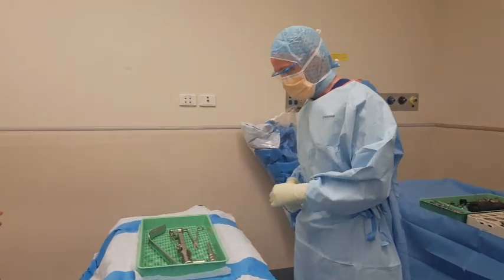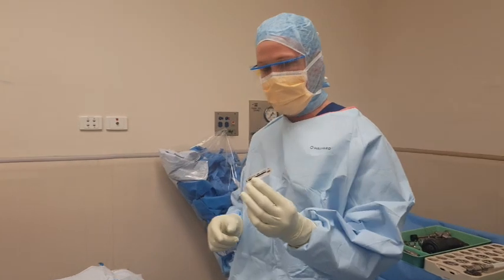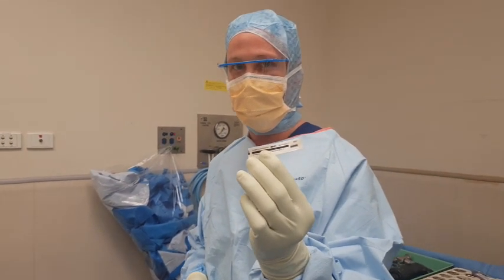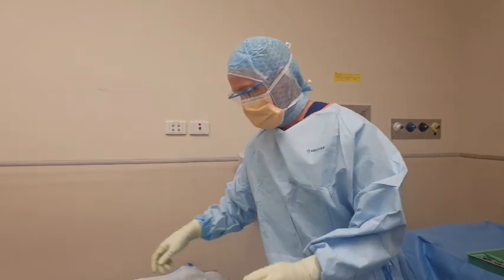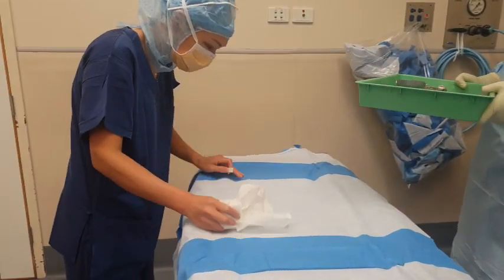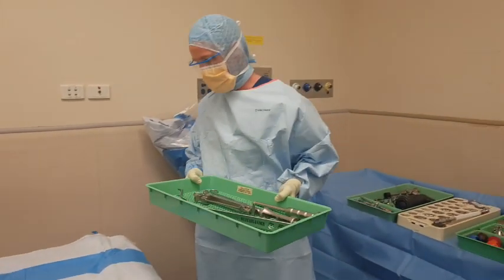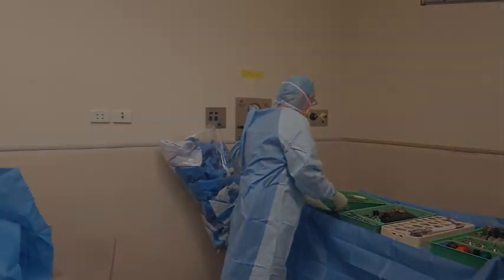One of the first things I'm looking for in the tray is this sterilisation indicator, which is the same as the tape on the outside. This is yellow before it's sterilised, and now it's turned to black, showing us that it's been sterilised. I'm picking up the tray, and then again, Maggie and I are looking for any breaks in sterility, any holes. If there were any holes, we put the tray down, change our gloves, and get another tray. This one's alright. Put it down, we're going to use it.